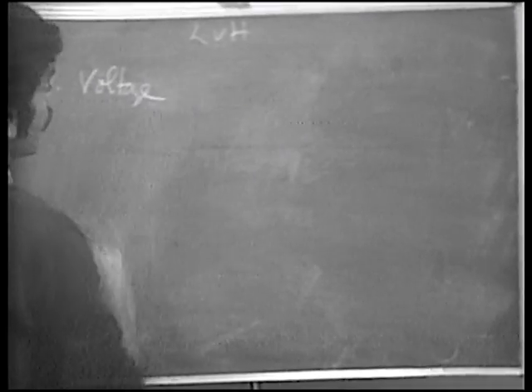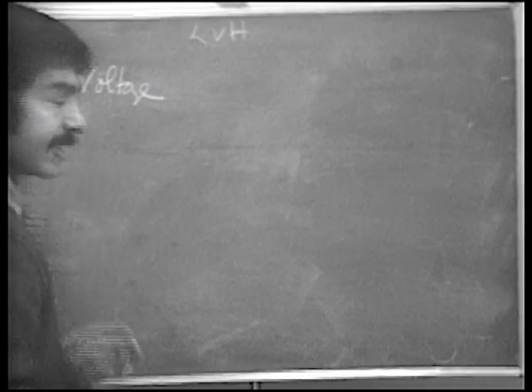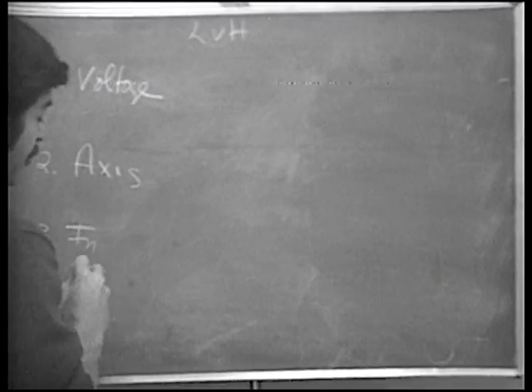Voltage criteria. So another criteria then would be axis. The third would be intrinsicoid deflection or ventricular activation time.